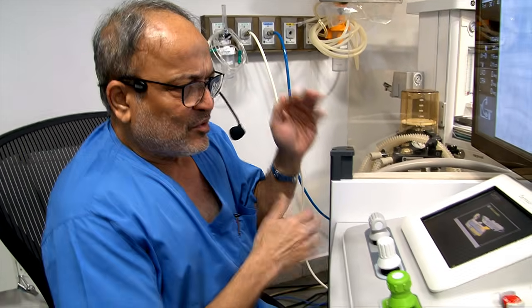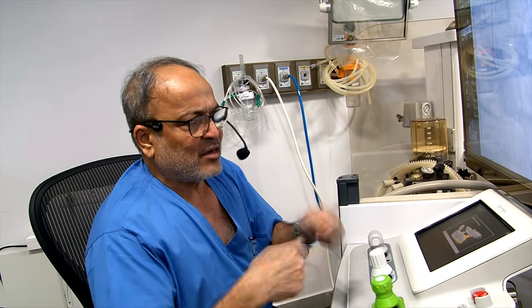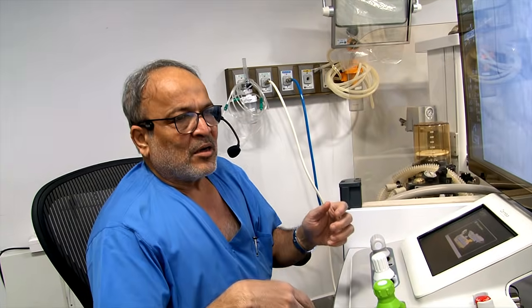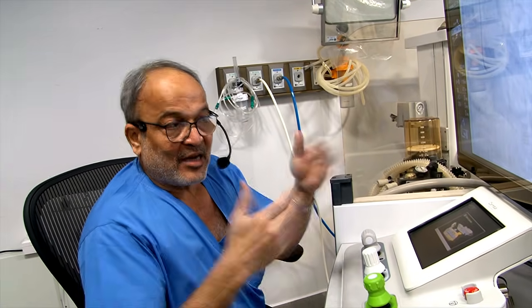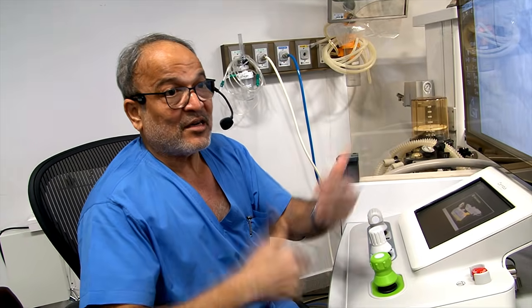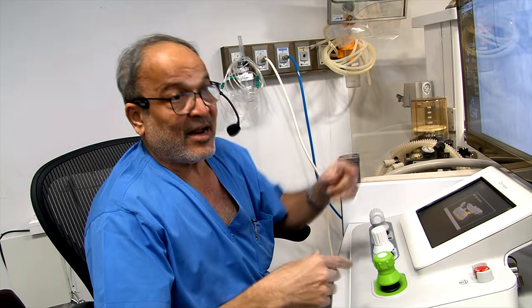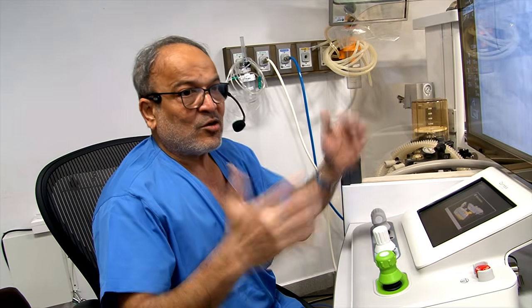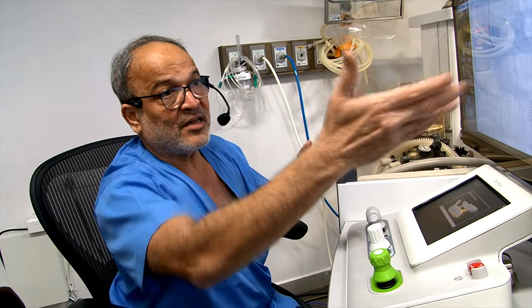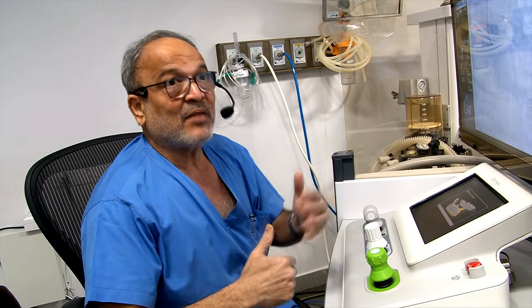Secondly, procedural time at the moment is much more compared to the manual procedure. Maybe a little more contrast at the moment, but with time we have seen that the contrast load, radiation time, everything is going down. Similarly, robot preparation time, we are measuring every case. The preparation time, what Yash and Sanjay showed you, has also reduced remarkably.